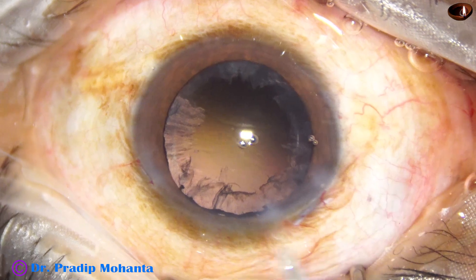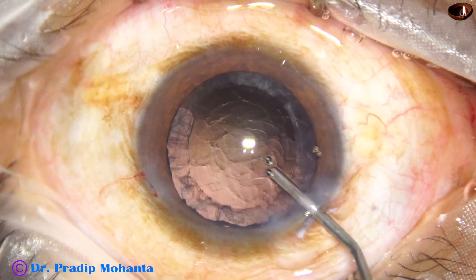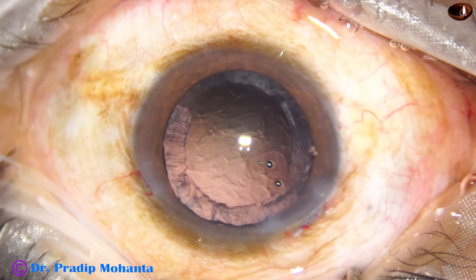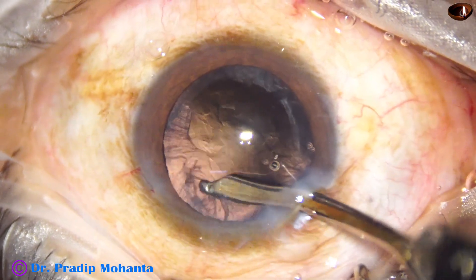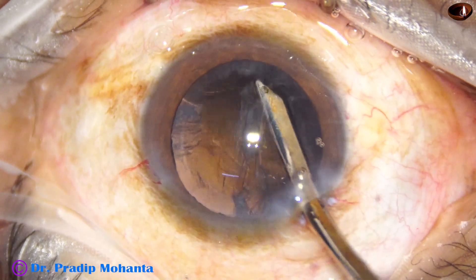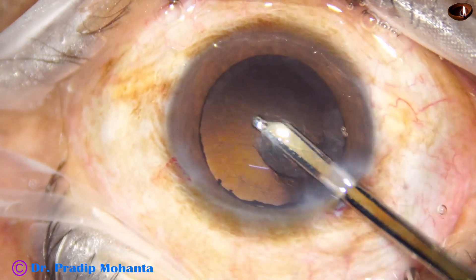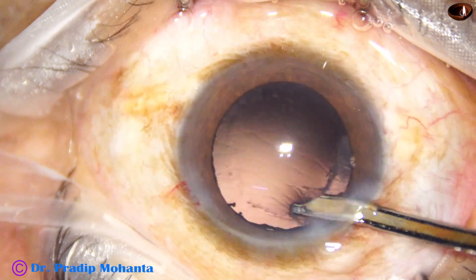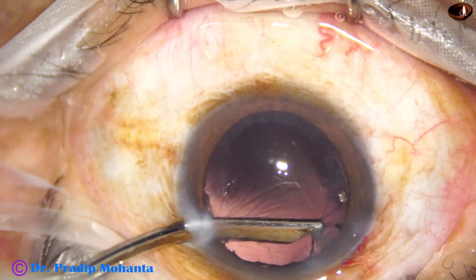Emulsify the nucleus, keeping the epinucleus, and at last the epinucleus is emulsified. The vacuum is 480 mmHg, power is 80%, flow rate is 48. During emulsification of the last portion of the nucleus and epinucleus, vacuum is 400, flow rate is 40, and ultrasonic energy is reduced to about 50%.